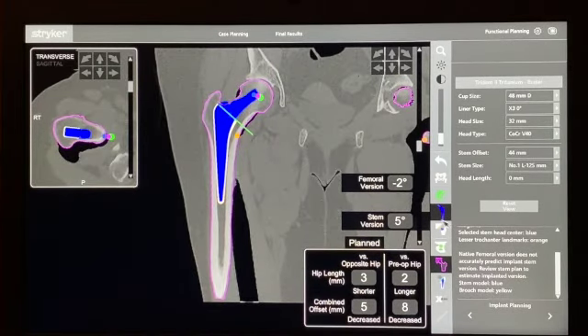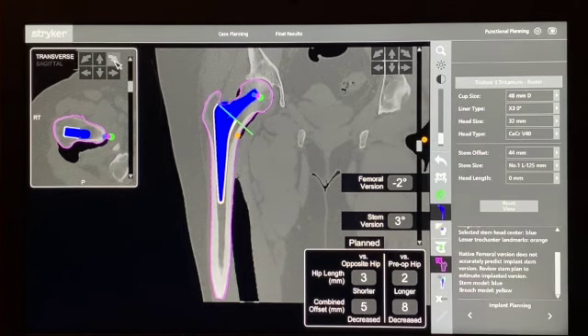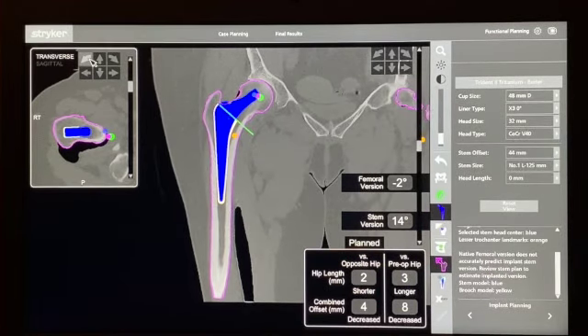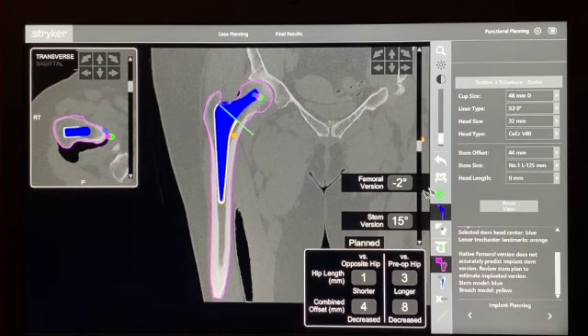For the femoral component, we want to match leg length and offset to the non-diseased hip, but if the hip is diseased we need to make a judgement call. The femoral stem version is currently only 5 degrees, whereas I'd like it around 15 to 20. This is a short 125-length, 44-offset stem and it's quite tight — the blue is the stem and the yellow is the cement mantle — and we're going to struggle to fit this in.